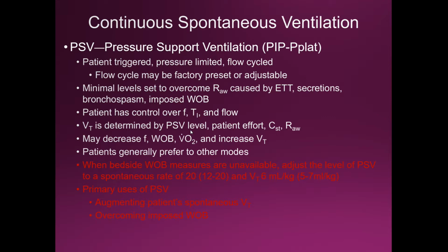Okay, so depending on what you say to me, it's going to tell me what you're talking about. This time we're talking about BiPAP. BiPAP has a pressure support. So the difference between the IPAP and EPAP is your pressure support, and your pressure support determines your tidal volume.